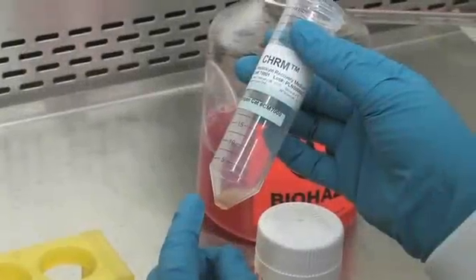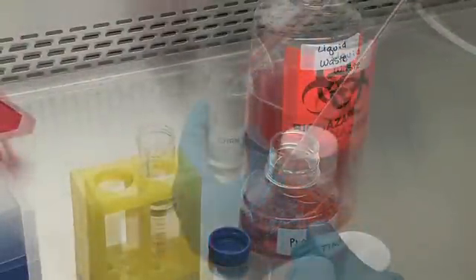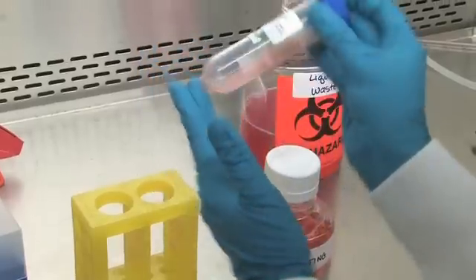Gently loosen the pellet from the bottom of the conical tube by gently flicking the bottom of the tube. Once the pellet is loose, add approximately 1 milliliter of media per million cells and complete the resuspension by gently rocking the tube.